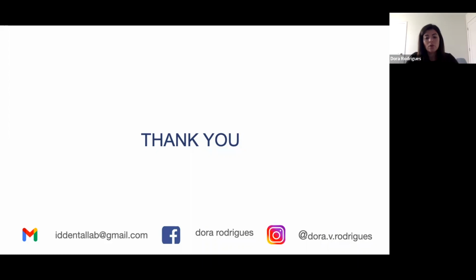Yes, correct. You want to make sure that you follow all the steps, and that goes from printing in the right printer to cleaning in alcohol at the right time, not letting it stay in the alcohol longer than it's supposed to, curing the right amount of flashes and everything else. It's like my dentures. I print them and then I leave them there, and the next day I come back, I bond them, and then I cure them together. There are protocols that you should follow and read the specifics, because you might want to speed up the process somewhere, and with that rush you might be not destroying but reducing the integrity of that specific material, because of those shortcuts that you might take.